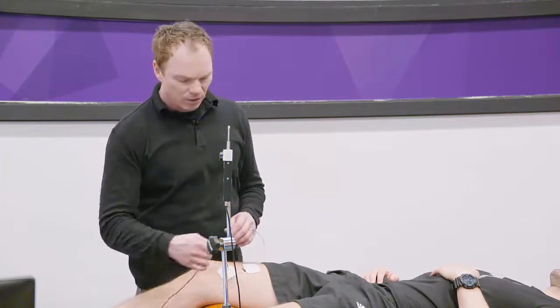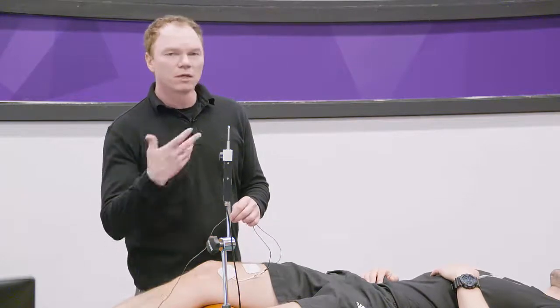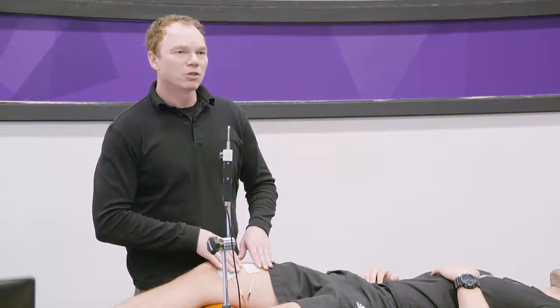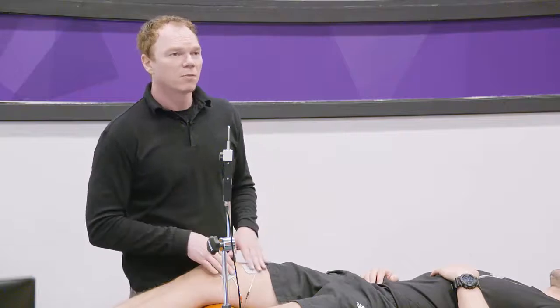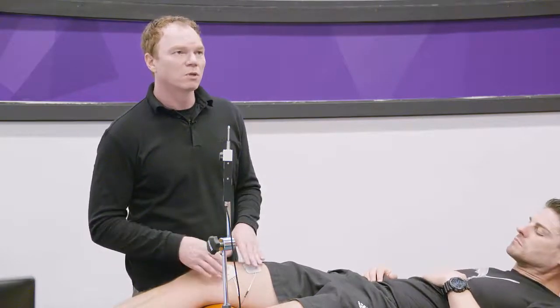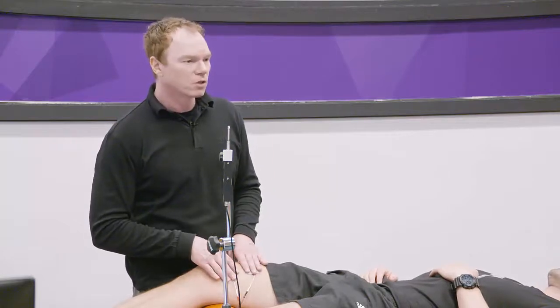The orientation of the electrodes will not affect the results, but if you read the research papers, they try to use the same positioning. One electrode — positive — always proximal; negative, distal, or vice versa. It depends on what you choose. It will not affect the results, but if you want to have the same protocol, you follow the same procedure.